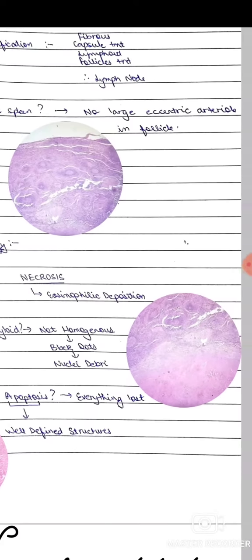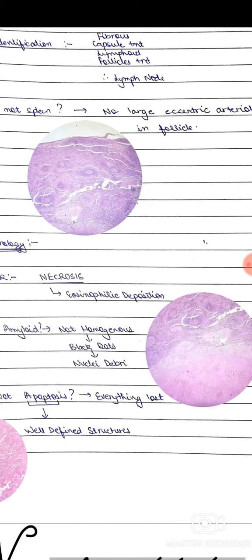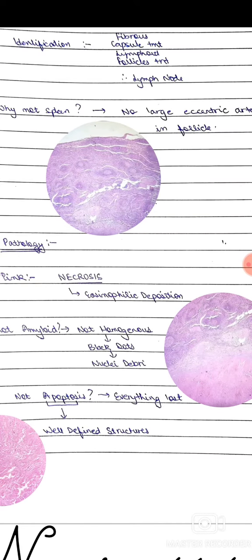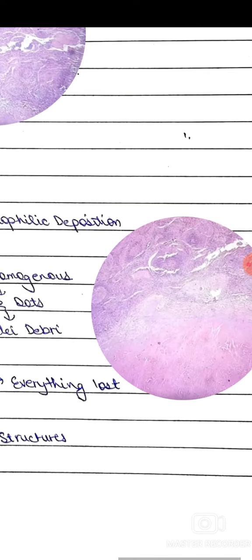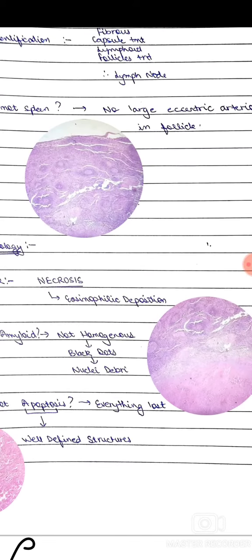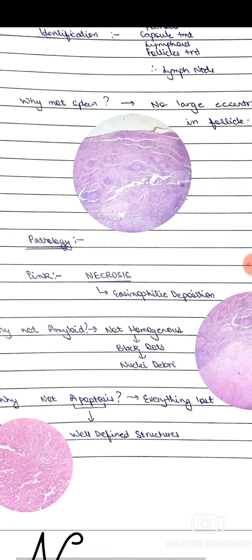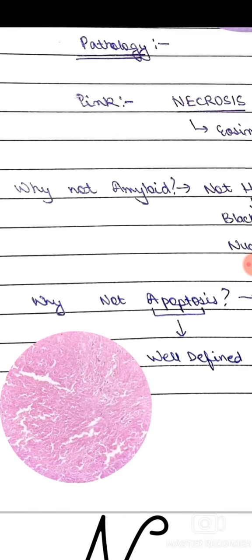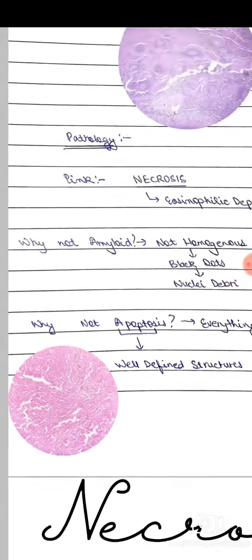Why is it necrosis and not amyloid? Because amyloid is homogenous, but this is not homogenous — we can see black dots which represent nuclear debris. Why is it not apoptosis? Because everything is lost, and in apoptosis we see well-defined cellular structures.